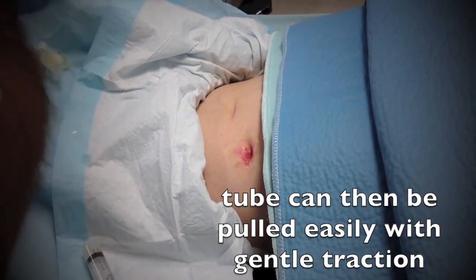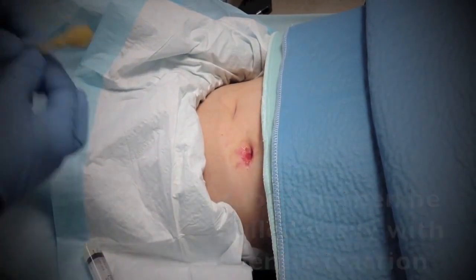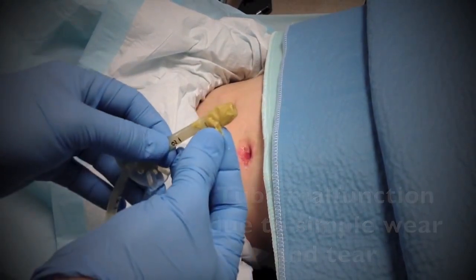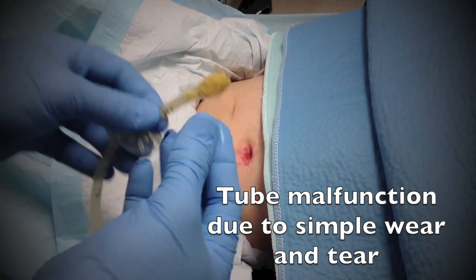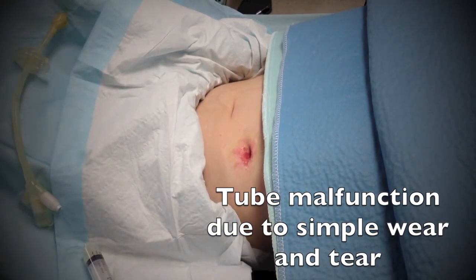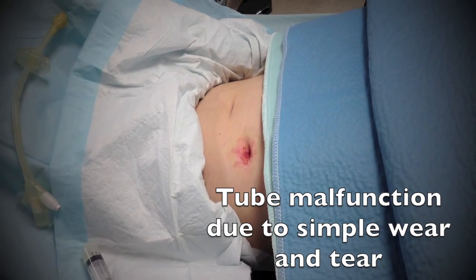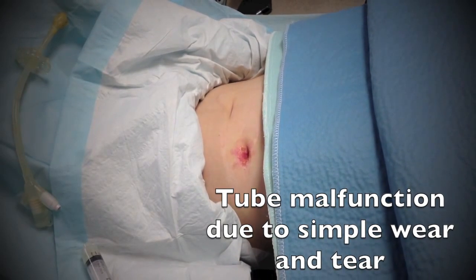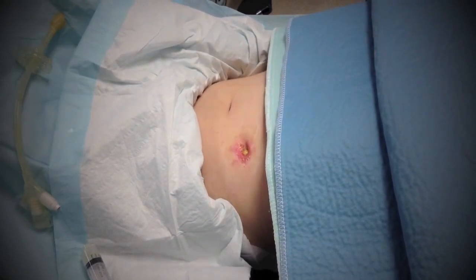And see, the balloon is actually torn right here. So this is why it malfunctioned. The balloon actually broke right there, and then it just deflates, and then the tube comes out. What makes it break? It's wear and tear. Like I was saying, a wheel of a car, or a balloon, or anything that's mechanical can break over time.